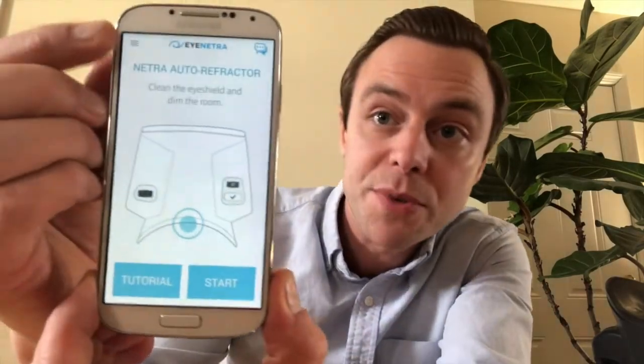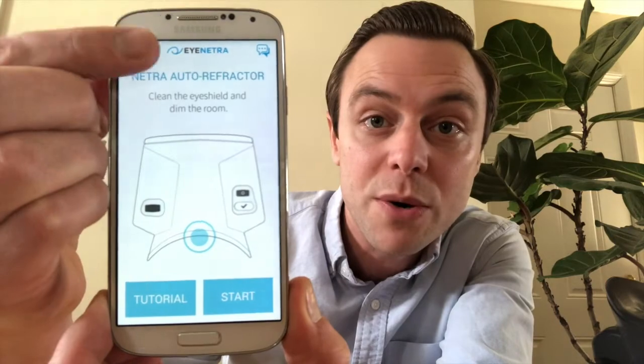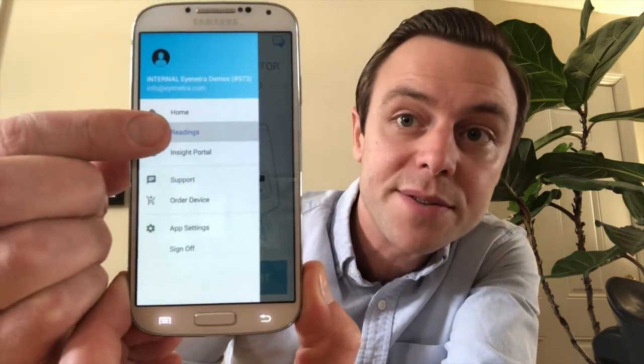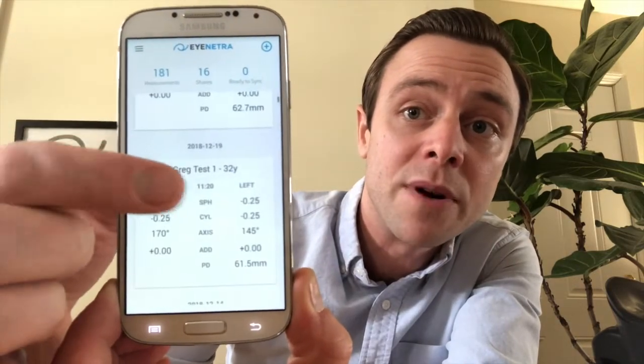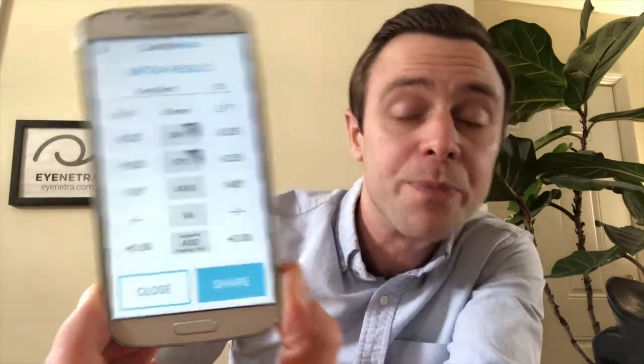In addition to the results being stored on the phone, they will also be stored on our Insight portal, which can be found at insight.eyenetra.com. You can log in with the same credentials used to log into your EyeNetra smartphone. To access the readings right here on the phone, just use the drop-down menu in the upper left-hand corner, select readings, and all of your readings will be displayed. You can tap on any one of them to go back and view. For more information about the results screen and how to change the powers, please check out the video on the results screen.